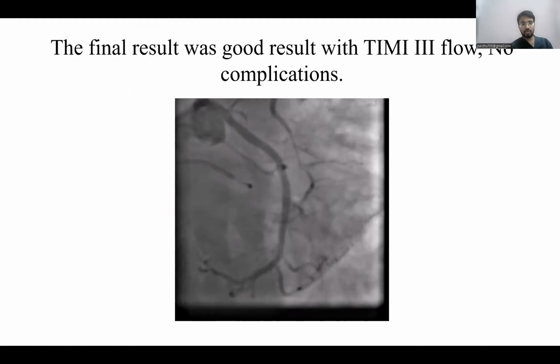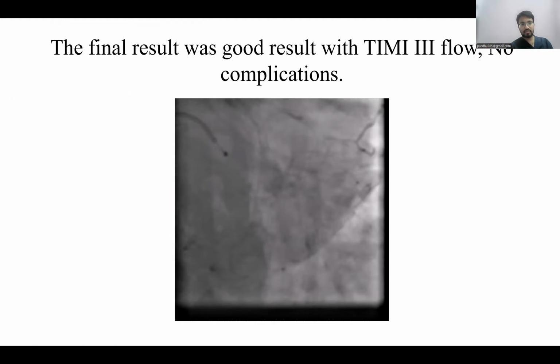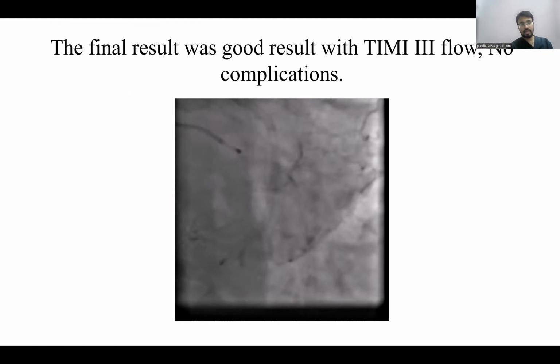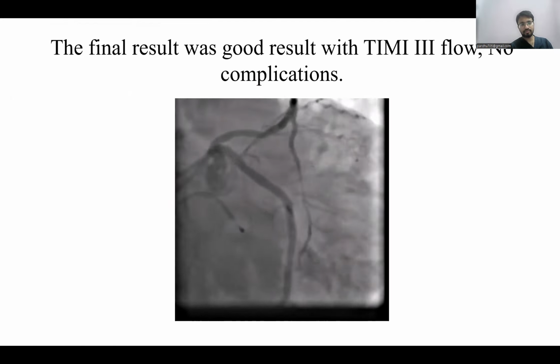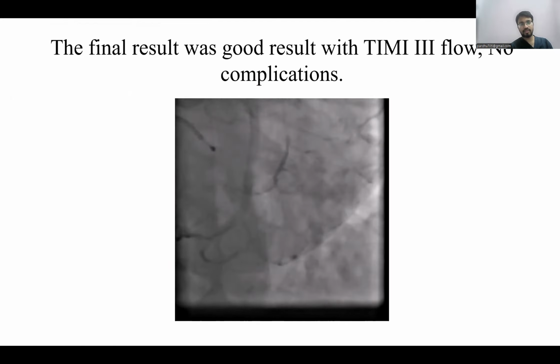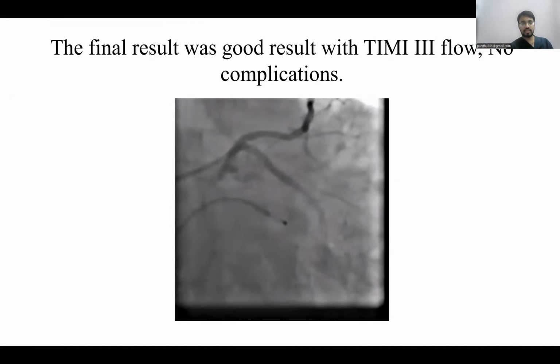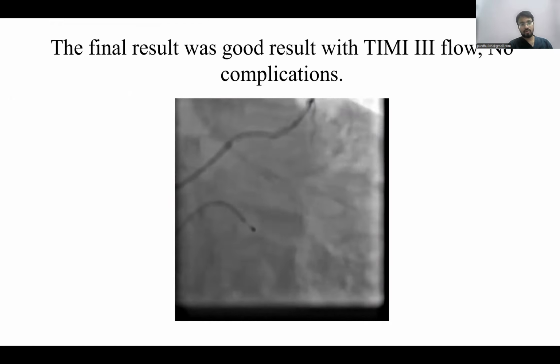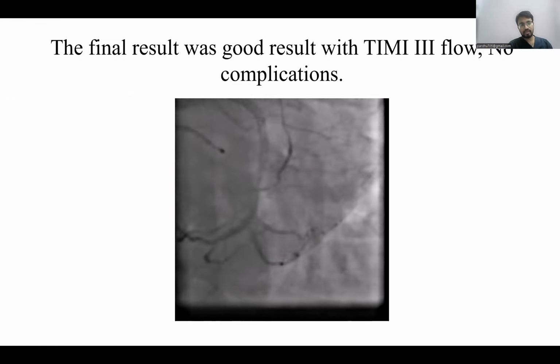And we have left the OM stent for medical management because it is being filled retrogradely from the LAD and the OMs. So this case highlights the importance of the rotablation when you are unable to pass your gear in the previously crumpled stent.